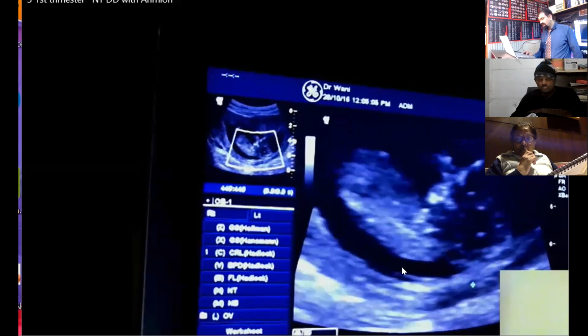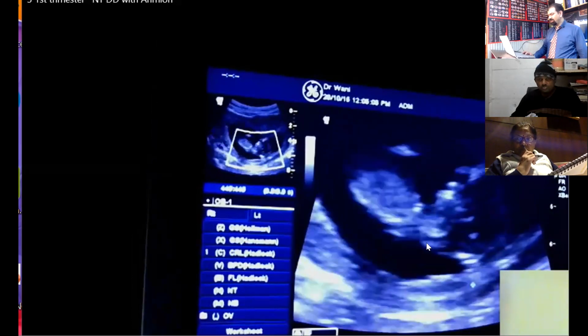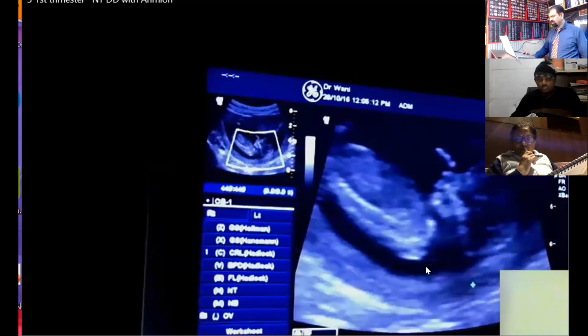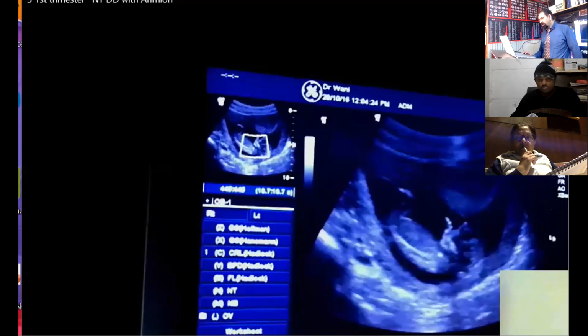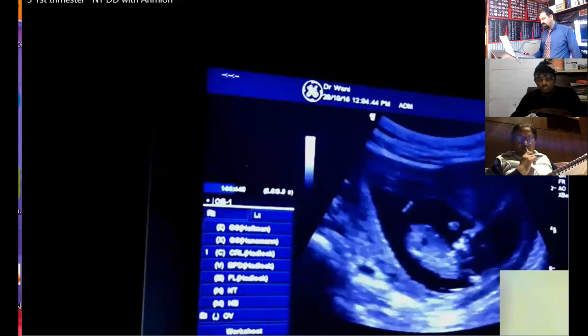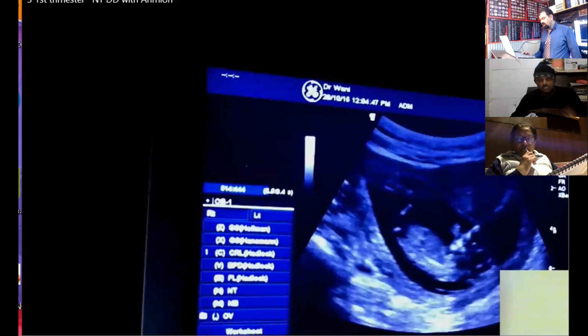Why am I showing you this? Because in this plane I am hitting it. Now see, this is the beauty. When the fetus is moving, this is not changing its position. So this is the point. Don't overdiagnose a case. Wait for the fetal movements to see whether I am dealing with a nuchal translucency or an amnion.